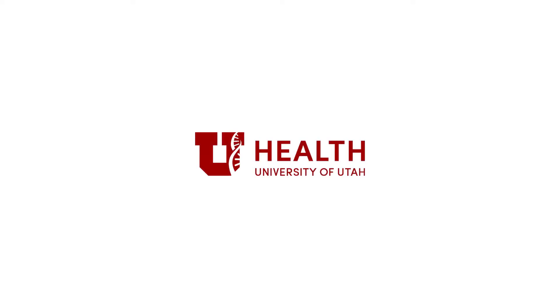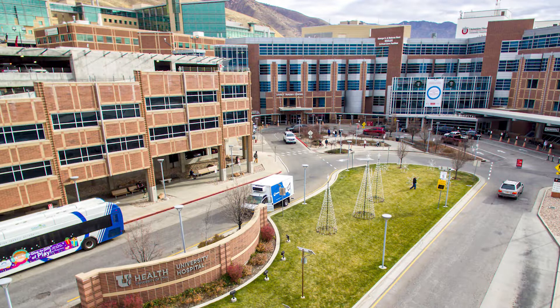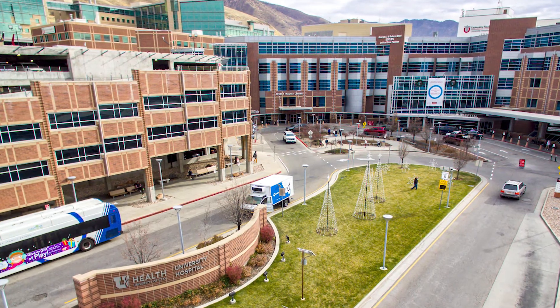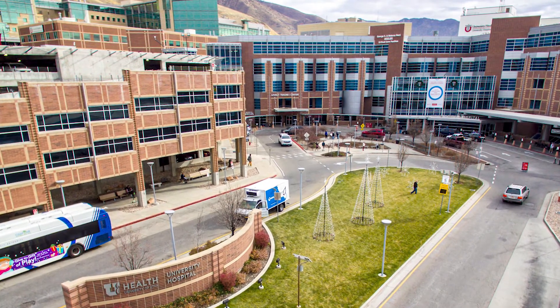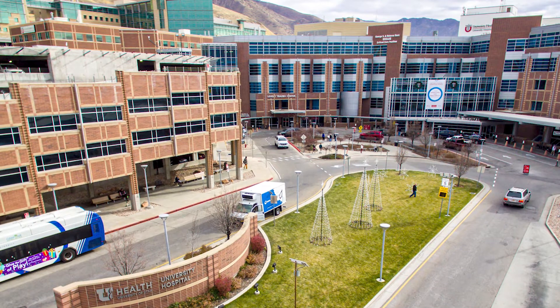To help conserve personal protective equipment and reduce contact between hospital staff and patients who have or are suspected of having COVID-19, the radiology department has developed a process of obtaining chest radiographs through glass windows and doors. This allows the radiology technologist to acquire a diagnostic CXR without entering the patient's room.